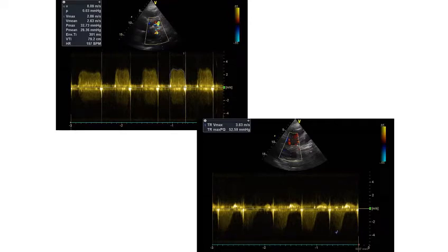In gynecological patients, sometimes hypovolemia is also being considered, sir. In that case we are sometimes not very confident in using IVC-directed assessment, less than 50% collapse, because we are not sure in intubated and pregnant patients, postnatal patients also.